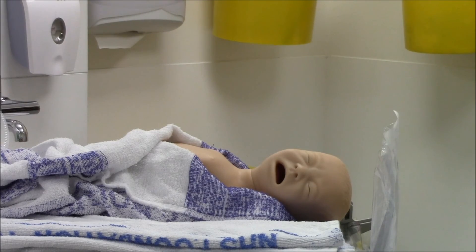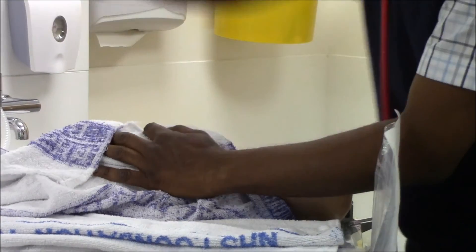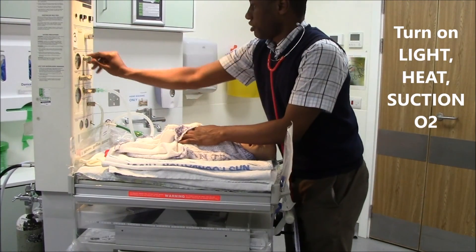Hi Doctor, can you feel he is not breathing? Right, so turn on the clock, switch on the heat, turn on the light, switch on the resuscitator.